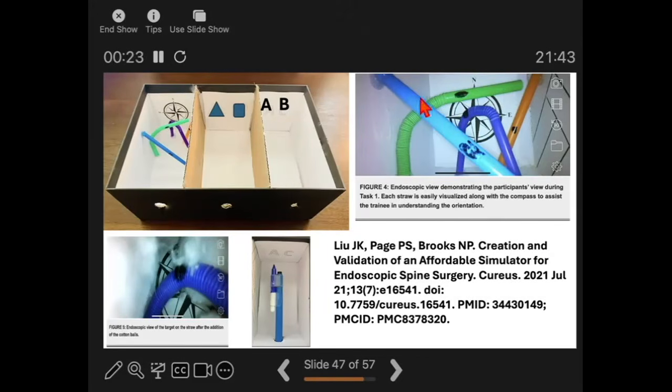These are at different levels. These are superficial, these are deep also, and of different colors: green, blue and brown, light blue, and the black marks are placed superficially and deep also. The instrument should be taken and touch the black points superficially and deep, and one should be able to negotiate between these two straws.